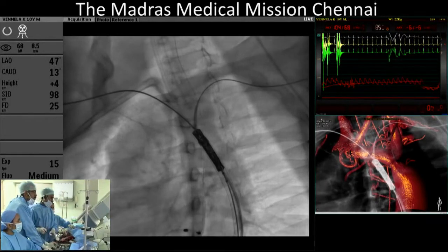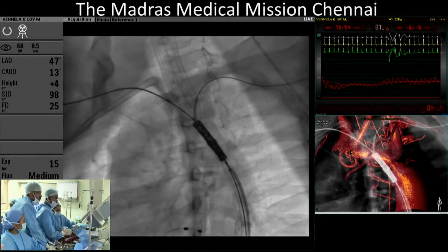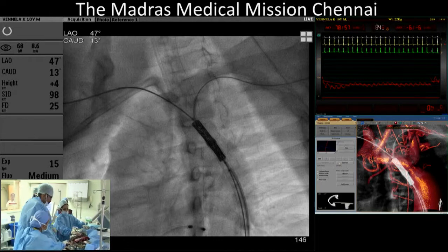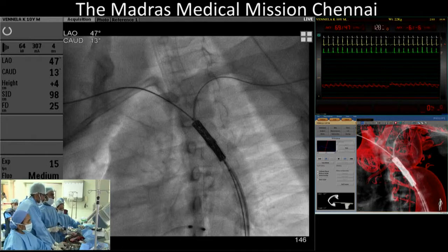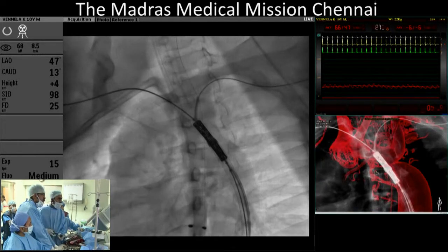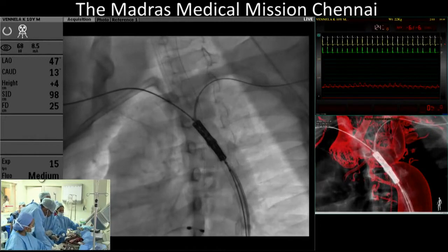Before going on, can you tell us what is the stent, the length, and the size of the two balloons mounted on? The balloon is a BIB balloon. It's 12 millimeter diameter and 4 centimeter long. The covered CP stent is 28 millimeter. 38 millimeters. 28 millimeter. So you have one balloon. The balloon is on the wire in the right side, yes?